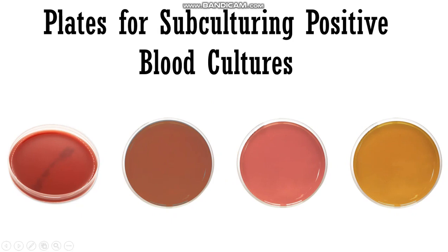Next, you can see here we have the chocolate agar, an enriched medium designed for fastidious organisms that may not grow well on blood agar. It's essential for isolating Haemophilus species, Neisseria meningitidis, and similar pathogens.